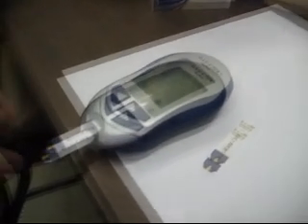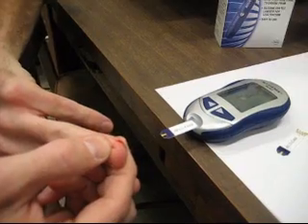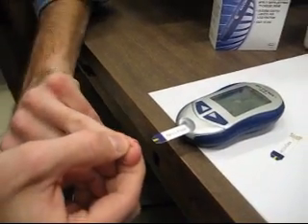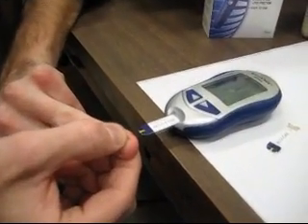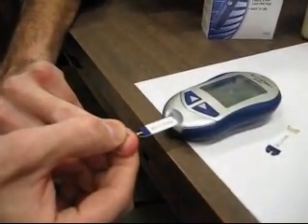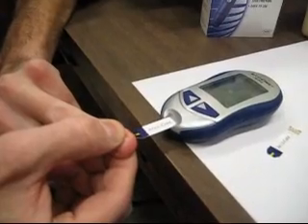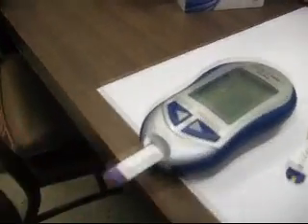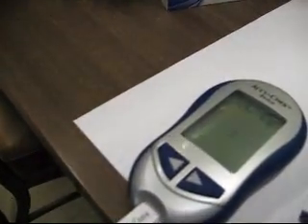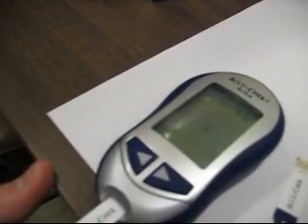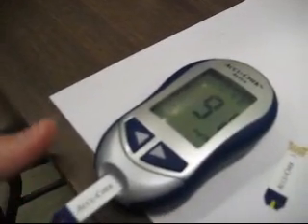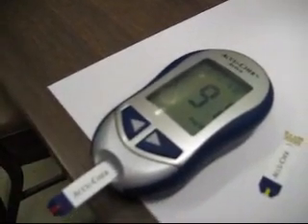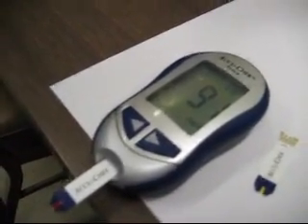Hold that blood drop. Hold the blood drop against the edge of the yellow strip. Blood will fill and the glucose meter will beep, and if successful, read a glucose value.